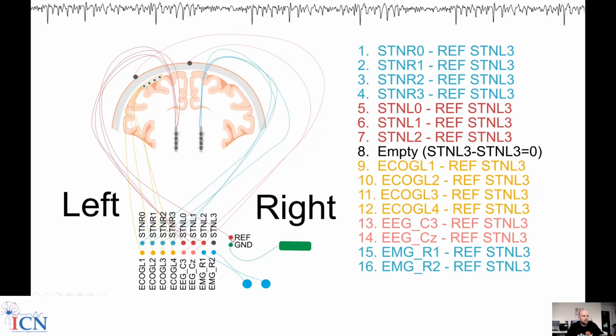If you, for example, use a different electrode, it may contaminate more of your signal. For example, if we would use an ECoG electrode, we would see a lot of ECoG activity in every single one of the LFP channels. That is because the ECoG electrode has a lower impedance and much higher signal amplitude. There are ways to deal with this, but we prefer, and many others do too, to use a DBS electrode or LFP channel as a reference.